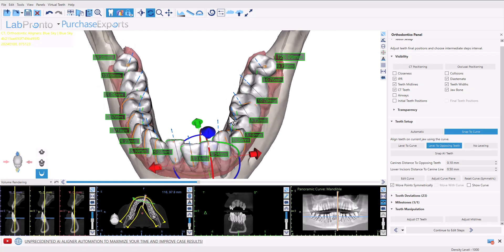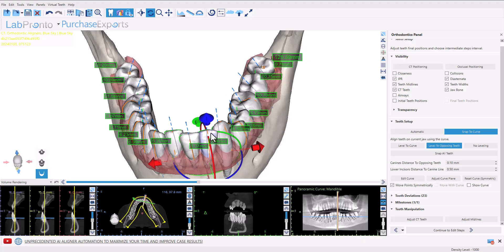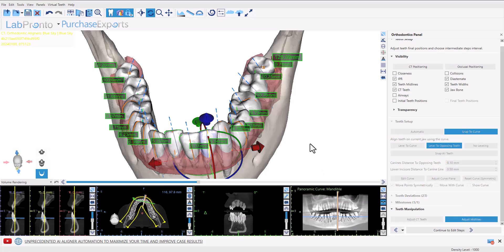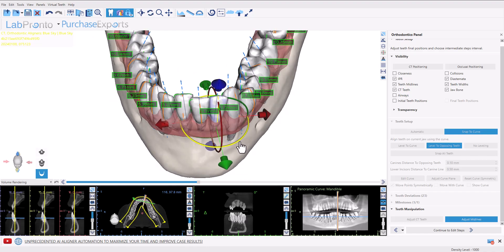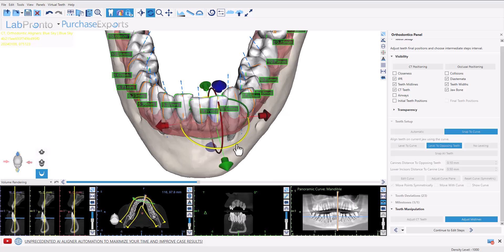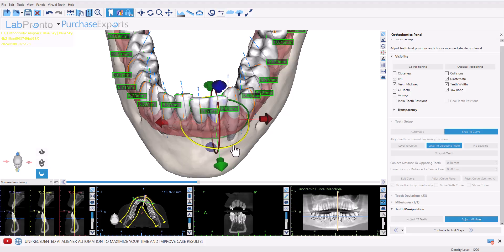If that needs to be adjusted, simply click on the relevant tooth to activate it. Click the adjust midlines button on the bottom right, and the widget allows you to rotate the midline without moving the position of the tooth. We can see that as we adjust the midline positioning, the measurement for the relevant tooth adjusts accordingly as well. Click the adjust midlines button once again to deactivate the functionality.